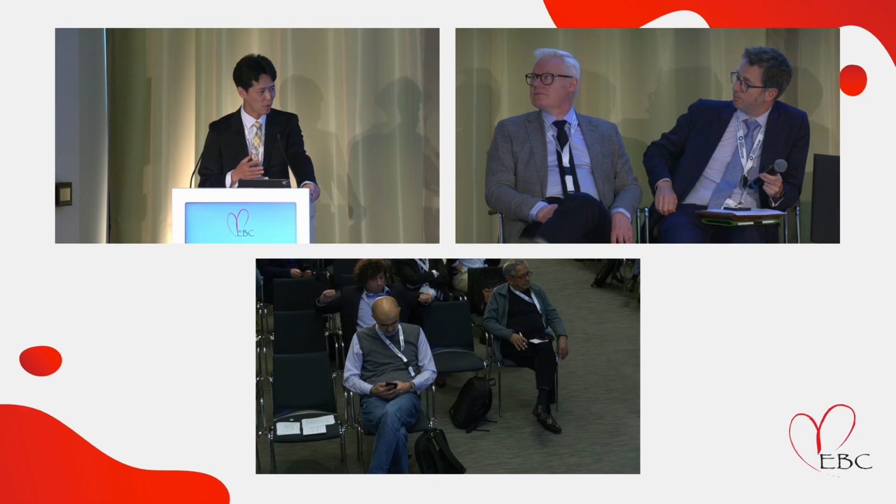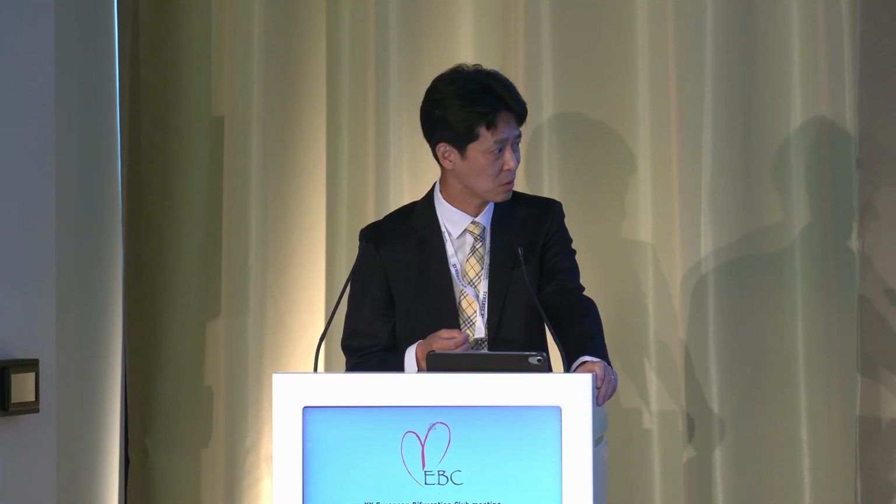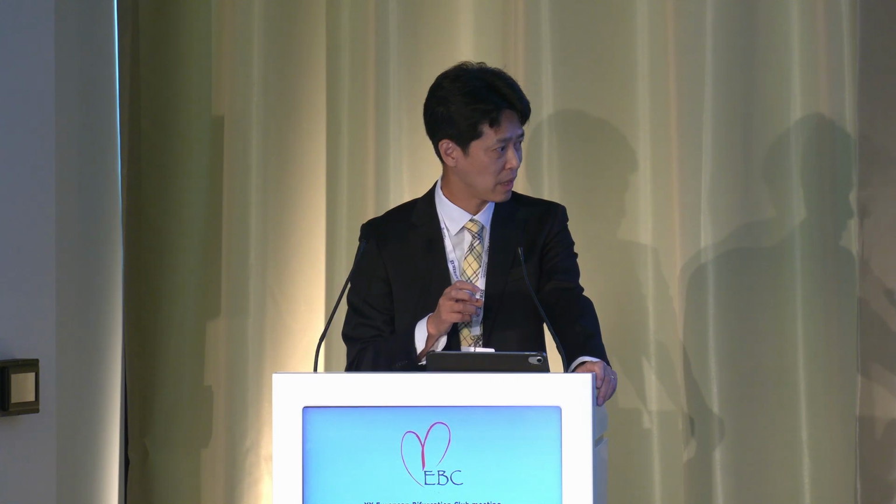Actually, we have a lot of types of bifurcation. So I believe in true bifurcation, IVUS guidance may be helpful, but if non-true bifurcation, actually it is hard to see the benefit of IVUS guidance.